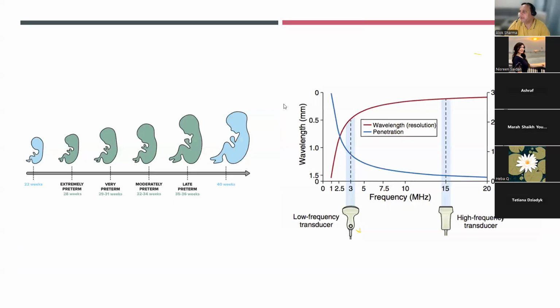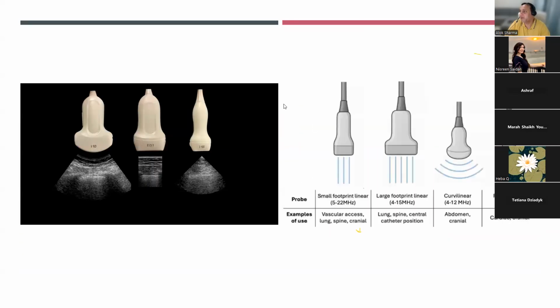So again, my apologies, my mouse is moving too quickly. This exemplifies the different probes that we use, and the common probes that we use will be the linear probe and or the hockey stick. The hockey stick gives really good frequencies.